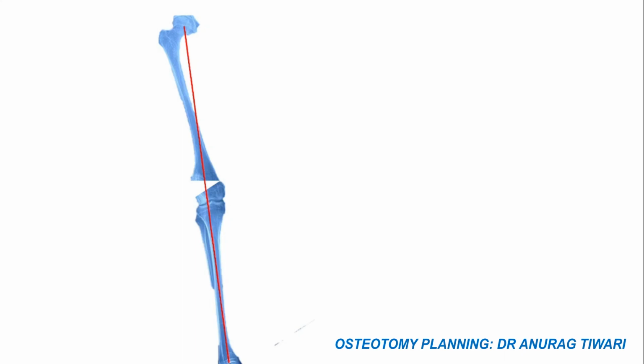In this case it is not passing, but I assume that this is the correct deformity because the deformity is too much and we have done only the femur side. So this angle is now LDFA, correct angle is 93 degrees. So you can see from the picture we need almost 29 degrees of correction, that is from the previous slide you can see 5 degrees and 24 degrees. So 24 degrees is in the femur we required and 5 degrees of correction in the tibia we require.